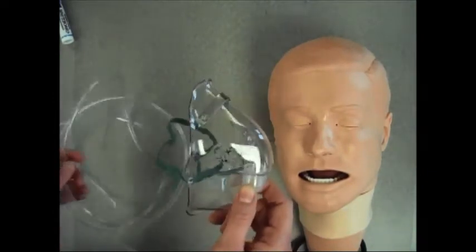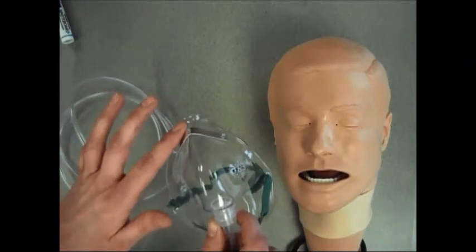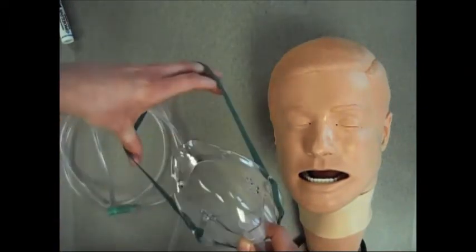When applying the mask to the patient, place the mask over the nose and mouth, then take the straps on each side to secure it around the patient's head.